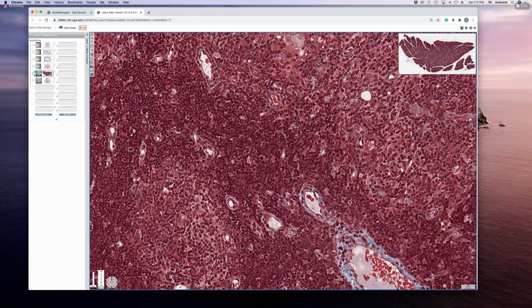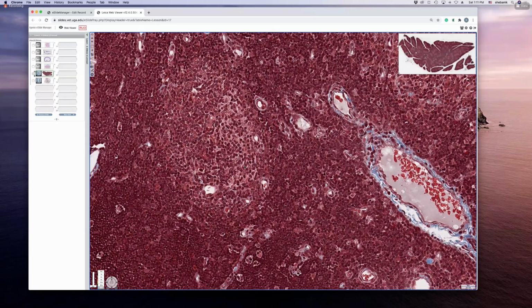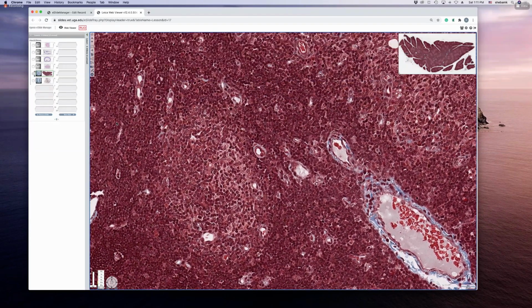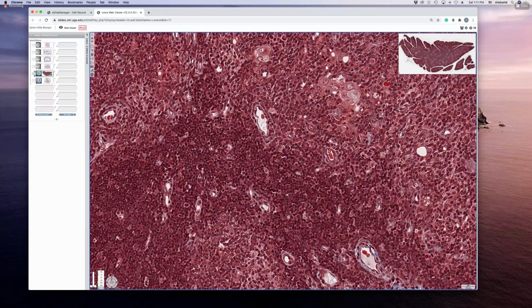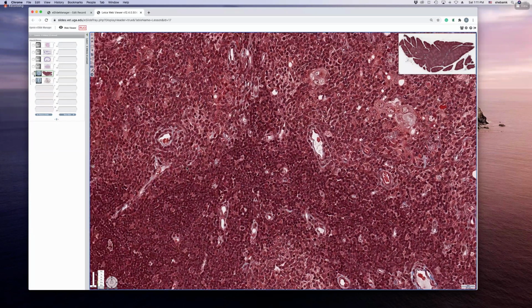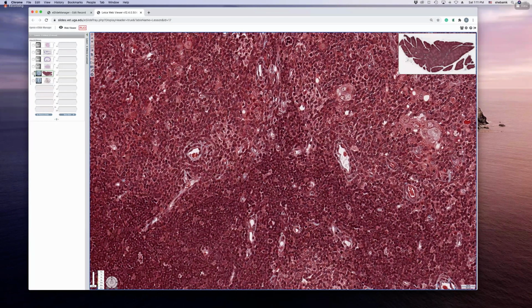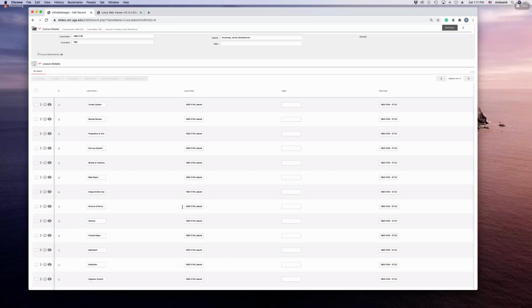The continuous capillaries are going to be present in the cortex, but if you come into the medullary region, you'll see a lot of fenestrated capillaries. These have holes in them, so that is how these lymphocytes escape and populate the thymus. So that is the thymus for you. Let's go to another lymphoid organ.